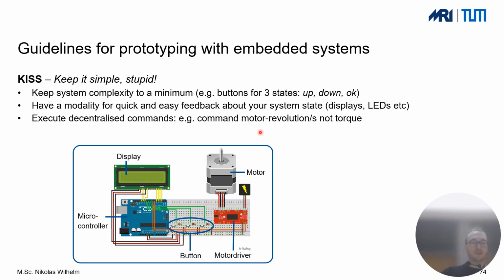Then finally, also just in general, some guidelines for prototyping with these embedded systems. Some takeaways that I can really highly recommend: when you get started with these projects, you're often highly motivated. You're like, okay, I want to get the new super duper design and want to get the best motor and the best sensors together. But you might not do yourself a favor that way, because in general, you should always try to keep it as simple as possible.